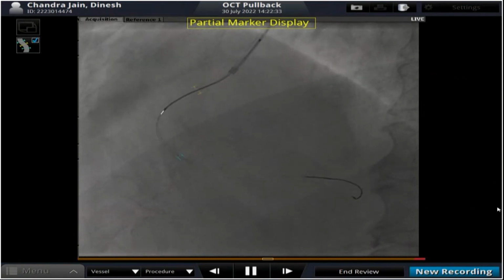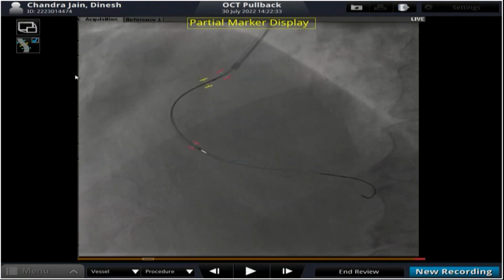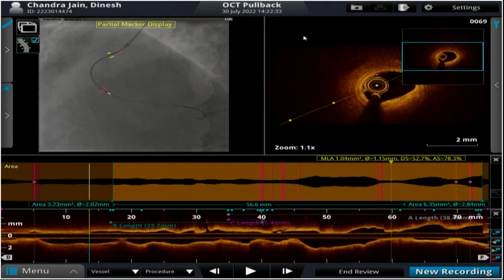Okay. Right. Great. So we are using a cutting balloon now, Wolverine 2.5 by 10, to optimize the proximal part of the RCA where we are seeing calcium, so that we will not have any difficulty in stenting that part, and we will get a very good result.